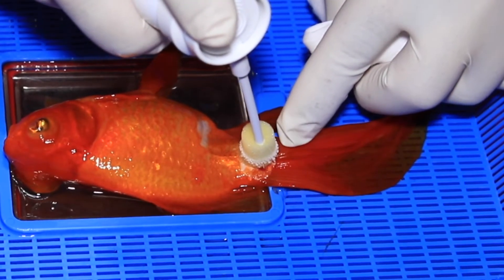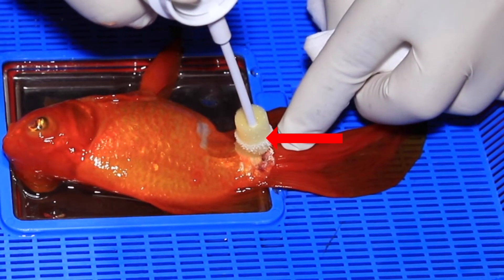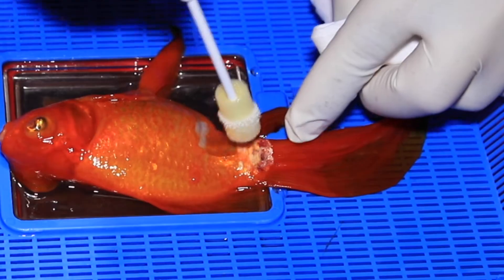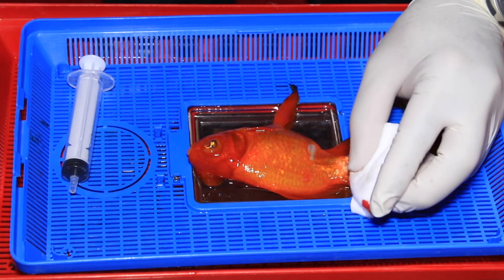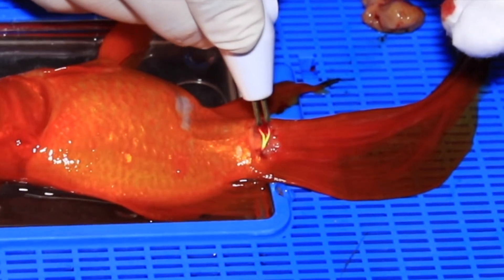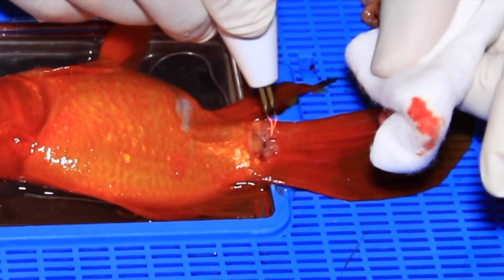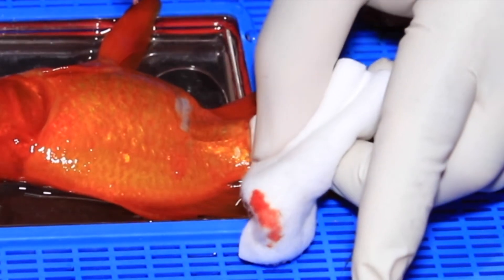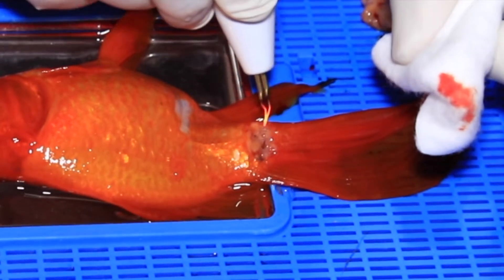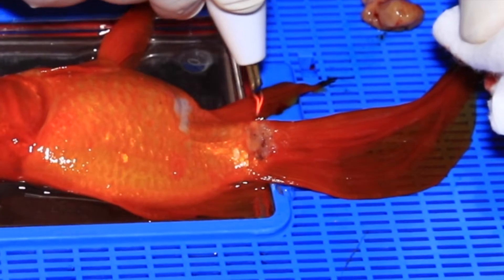You can see moisture from the air condensing around the applicator sponge — it appears as frost. Now we're getting some more bleeding, so I'm applying digital pressure on the wound. I'm going to go again with our electrocautery to find the blood vessel we need to sear. When applying electrocautery, you just do quick dabs onto the site because we don't want to cause too much thermal damage to the surrounding tissues.